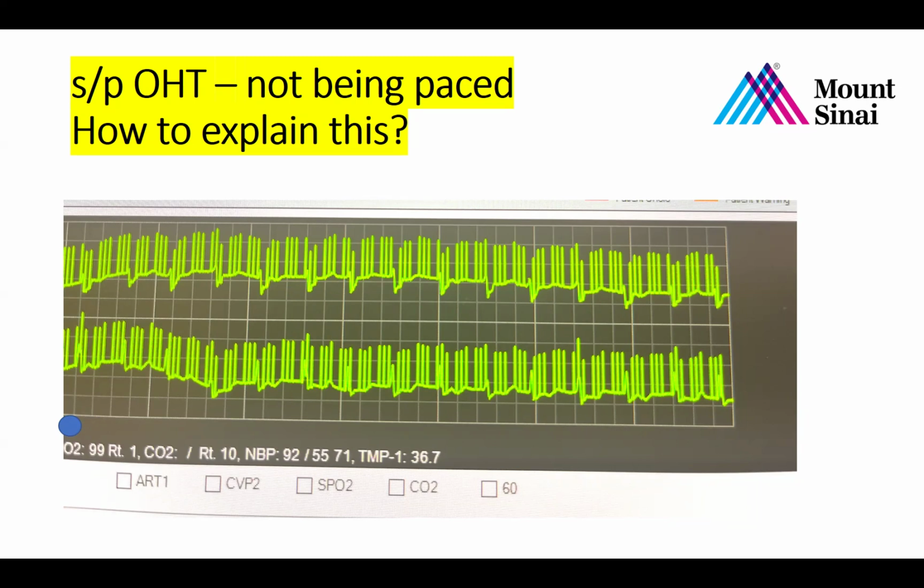The other reason I don't like this modality is because people confuse the presence of a spike, let's say it's working properly and only detecting pacemaker spikes, with capture, which are not, of course, the same thing. If you're pacing at too low of an output, you'll have a pacing spike, but you won't actually have capture. I have seen that error made, where the bedside personnel thought the patient was being paced, but they weren't capturing, and so the patient's heart rate was very low and much lower than the paced rate. So I've never really been a big fan of it.